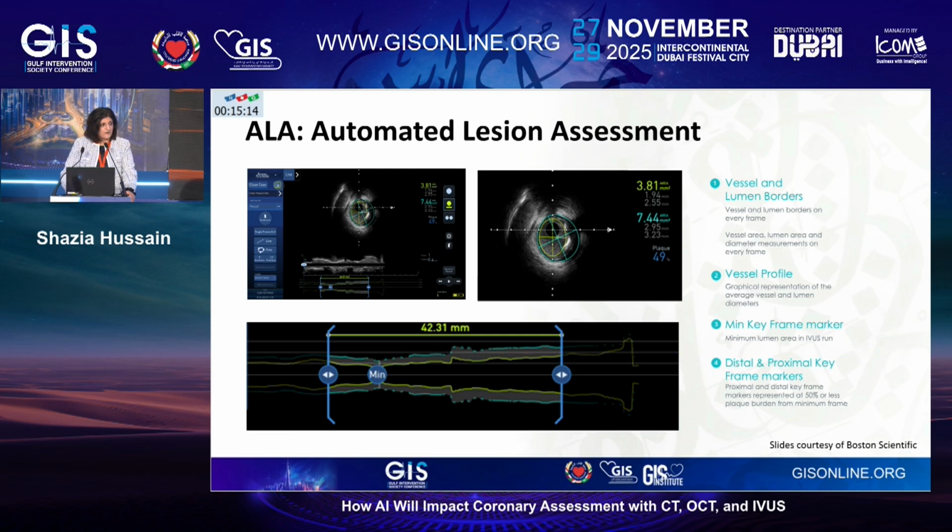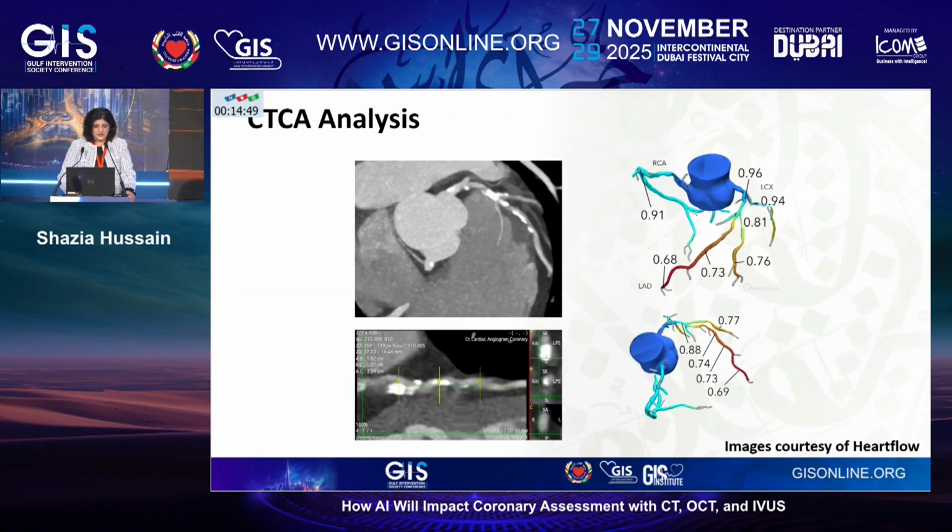And then for those who have it, the AVVIGO software with IVUS, also similar in allowing us to automatically get the lumen size and get the length of the lesion as well. And it can give you a vessel profile and also vessel composition with the amount of calcium, etc. And with CT, we already use AI.